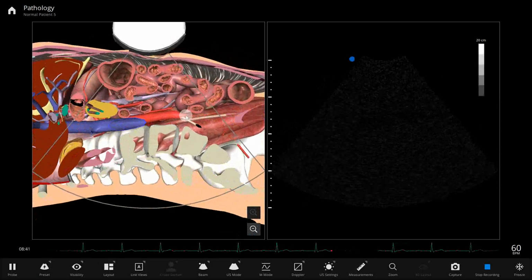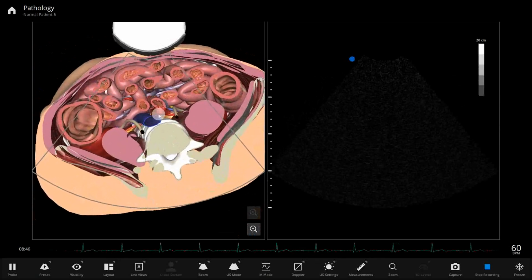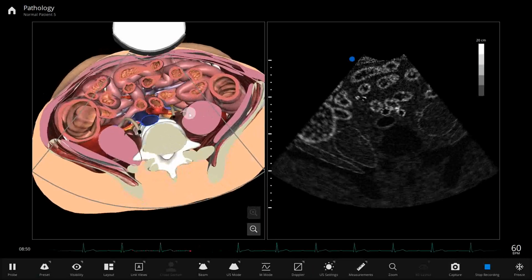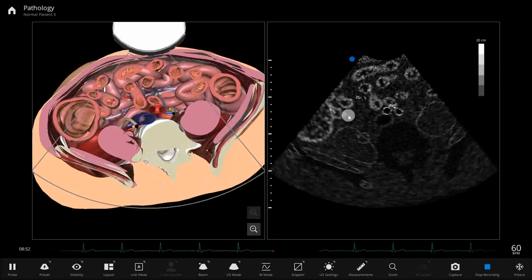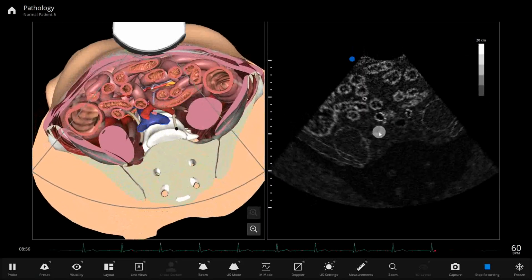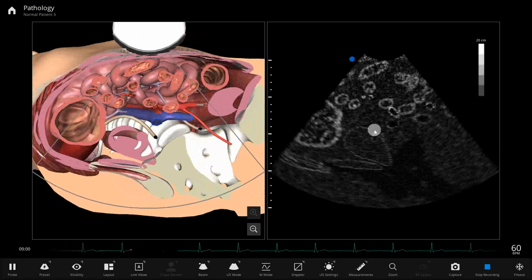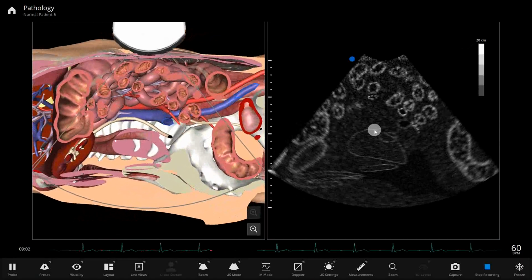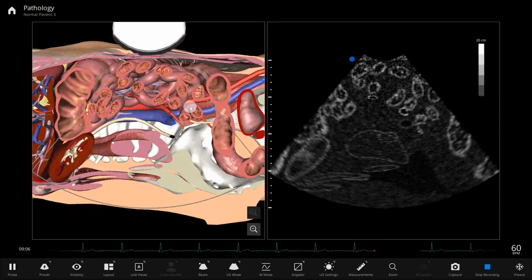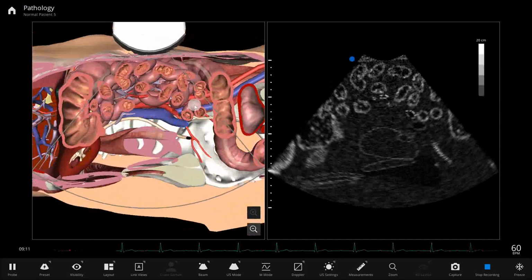Okay? And then the last thing we're going to have are the two iliac arteries. The aorta is going to bifurcate into a right and left iliac artery. You can see the split here on an anatomic one. Let's look over here. You'll see it gets wide, and then we split into two. Okay? Right and left common iliac arteries, they're going to split again into an internal and external iliac artery.